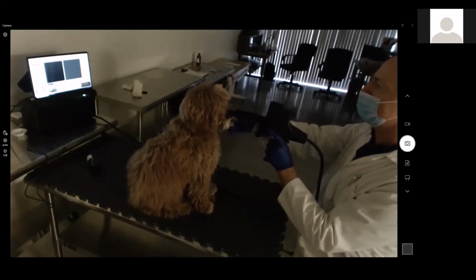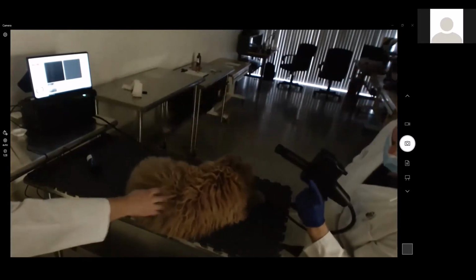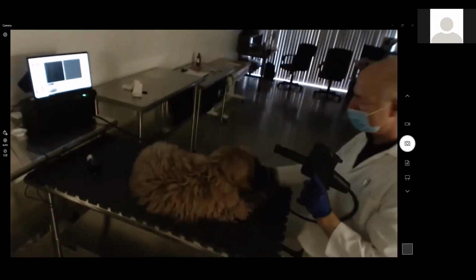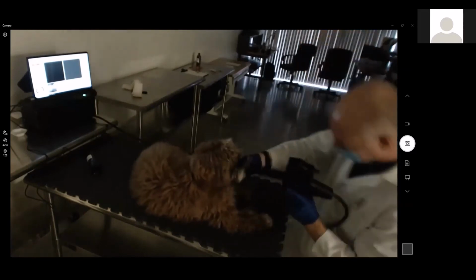There is the iris. Good boy. All right, see how fast he loses his attention? This is always a fun part of working with animals. Okay, come here. Come up. Good boy.